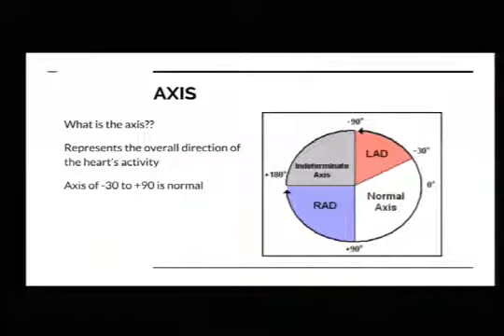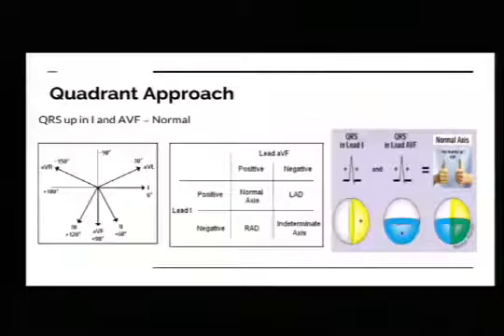Right axis means it's taking longer for that electrical activity to get over here. Up here means you either have your leads on wrong or they've got some weird kind of heart transplant, prosthetics. You should never really be up here. If it's up there, something's very wrong with their conduction system or your leads are in the wrong place. So kind of just a depiction.